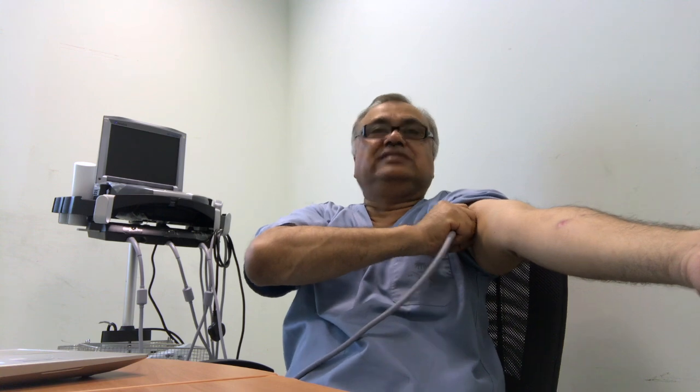It depends on where you go up from. Musculocutaneous is most easy. You go like this and put it like this. You will find enough. Go like this, reach the end, and just go like this. You will find a star-shaped structure.